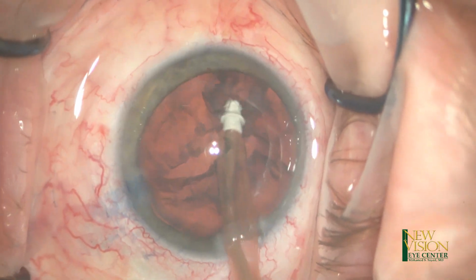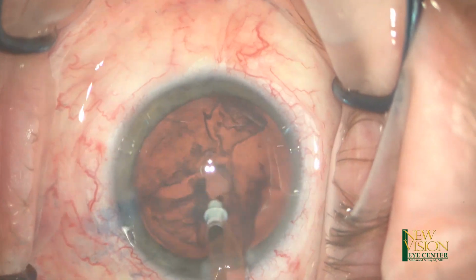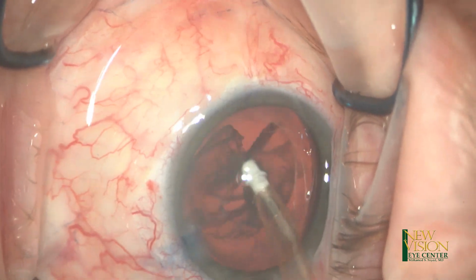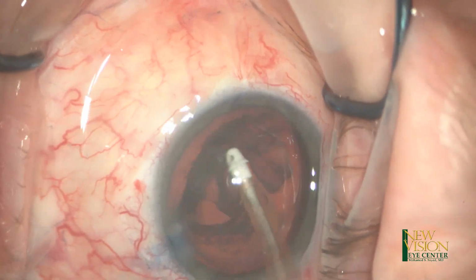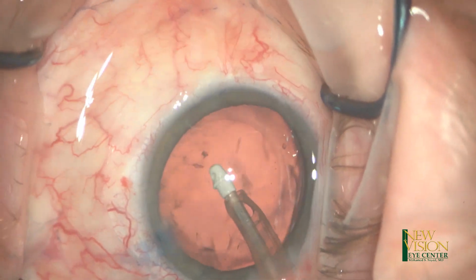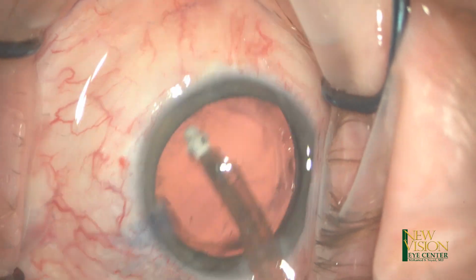And then I proceed to cortical removal with the IA tip. I try to keep the inferior cortex until the very end to avoid injuring the zonules while there is any cortex still remaining.